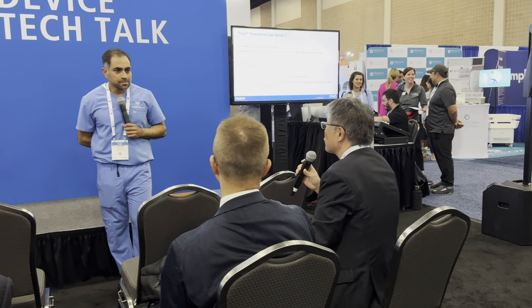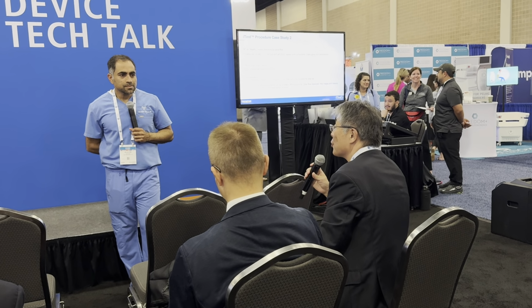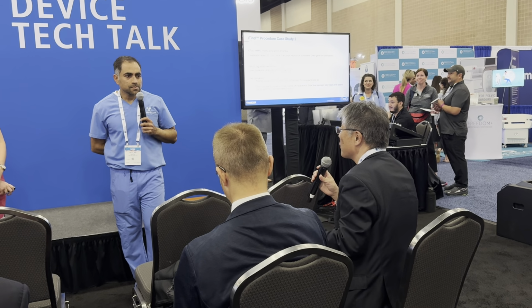I'm worried about the sphincter injury by the dislocation of the device. So the question, I think, was whether there's worry about impact on the sphincter by the location of the device. The device needs to be placed, you should not be placing the device at the sphincter. It has a leaflet that keeps it in place so it can't slip and get into the sphincter. If the device were in the sphincter, you'd imagine they would have significant incontinence afterwards. That's not something that was really reported in the data, nor in my experience. So I'm very confident on the incontinence or risk to the sphincter.